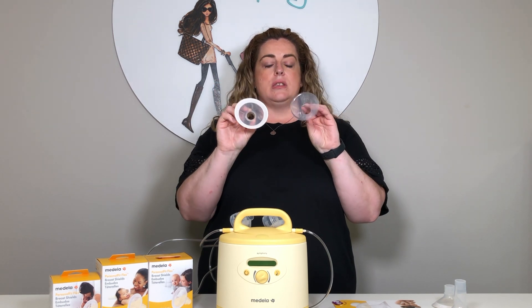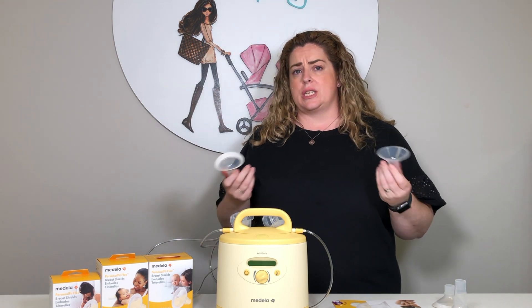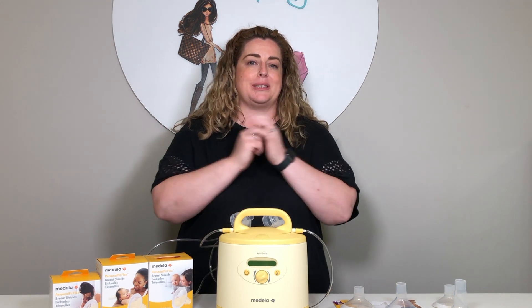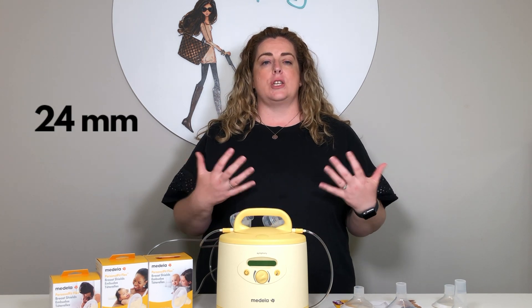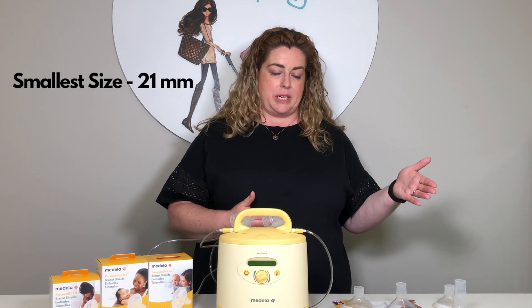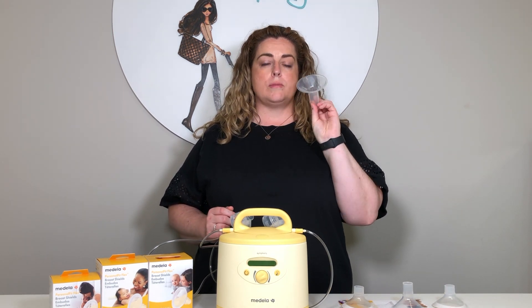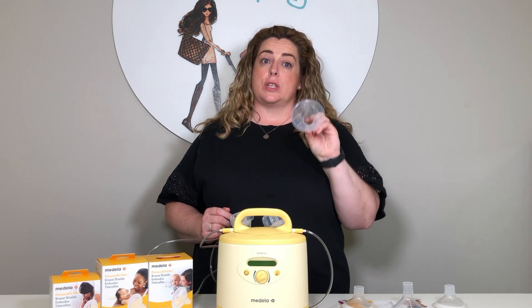Luckily, on the packages they will tell you which size they are, and that helps you understand which size you need. The size that will come with your pump is a 24 millimeter — that is considered the most average size. They also come in a 21 millimeter on the smaller end, and go up to a 30 millimeter in the flex shield range, but they still have the original breast shield in a size 36, which is quite large and necessary for some people.